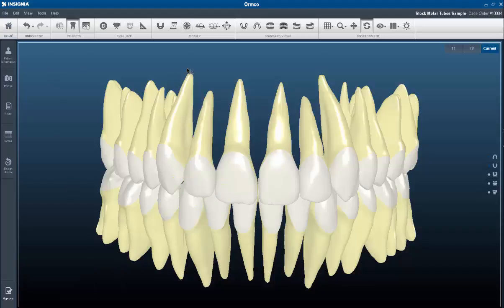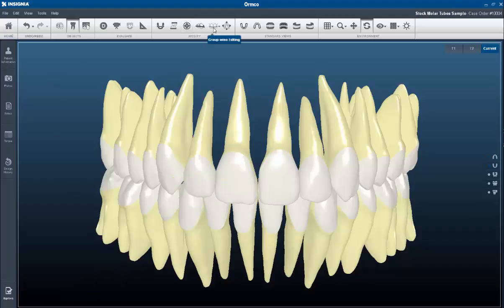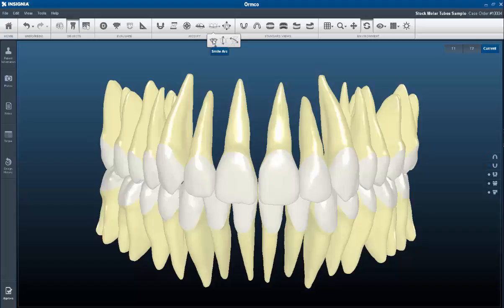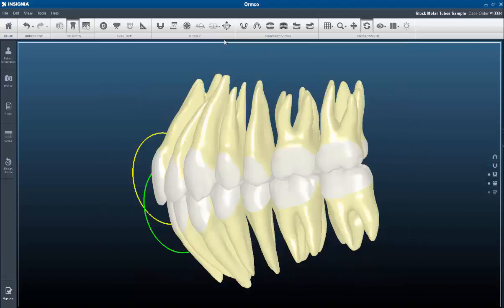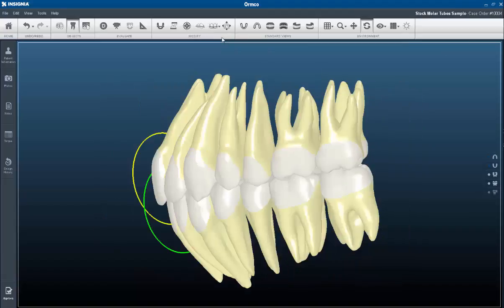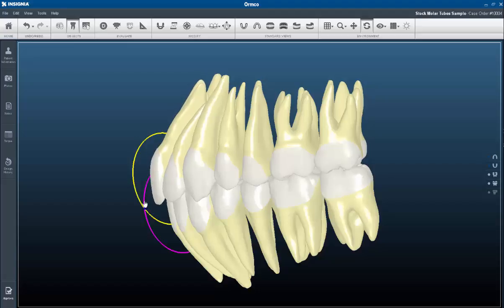Groupwise editing now has three tools, two of which are new. The smile arc tool is the same as before, but we have also added anterior torque and posterior expansion. The anterior torque tool allows you to adjust the torque of the anterior segment easily, rather than having to adjust individual teeth.